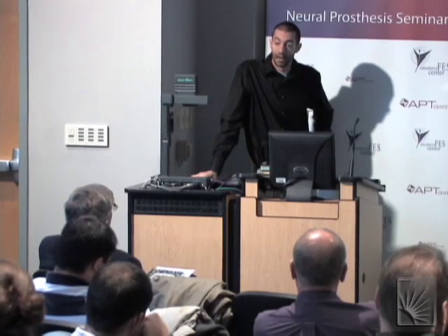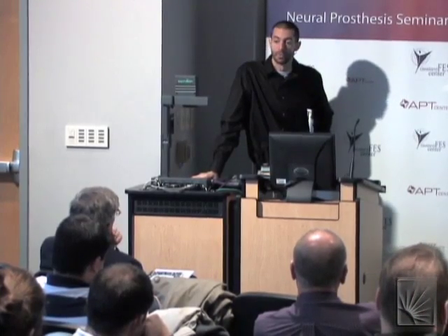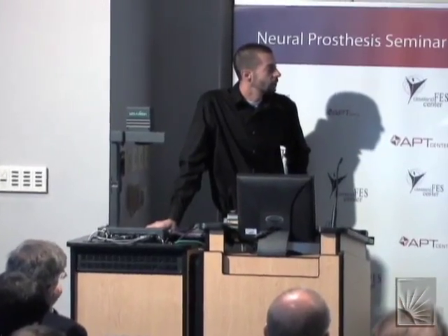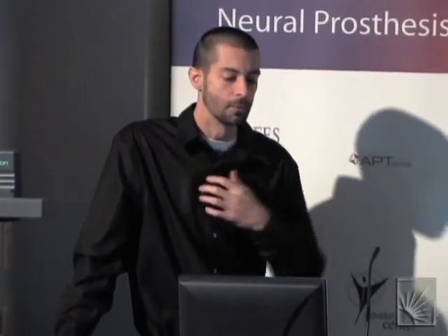People are working on that, yes. To my knowledge and what I've seen, it has not been very successful. And the reason is that the noise characteristics are so variable. You can't anticipate, maybe there's more 60 hertz noise one day than another. Maybe the background activity in that particular patient's brain is different.